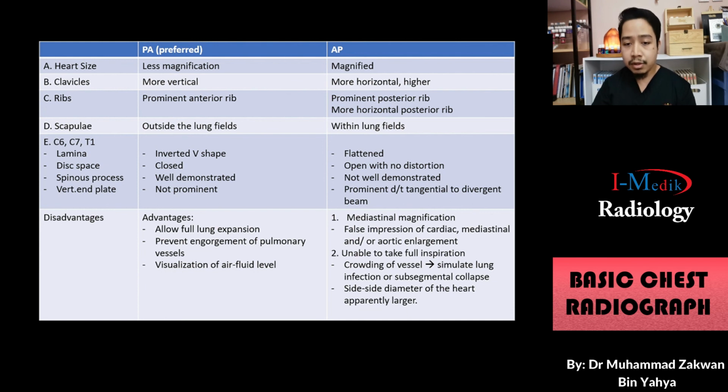So the advantages of the PA radiograph: the image will be taken in a standing position, so it will allow full lung expansion, and it will prevent engorgement of the pulmonary vessels, and we can see the visualization of the air fluid level.